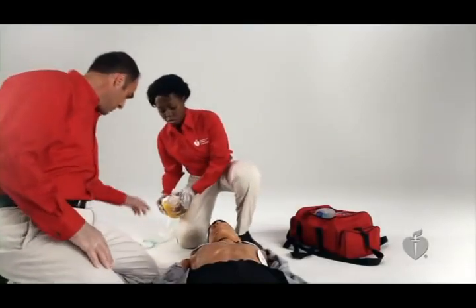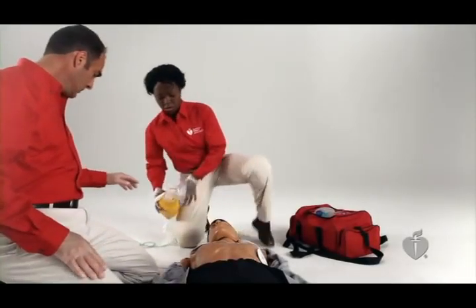Then loudly state a clear the victim message. It can be something like, "Everybody's clear," or simply, "Clear." Perform a visual check to ensure that no one is in contact with the victim.